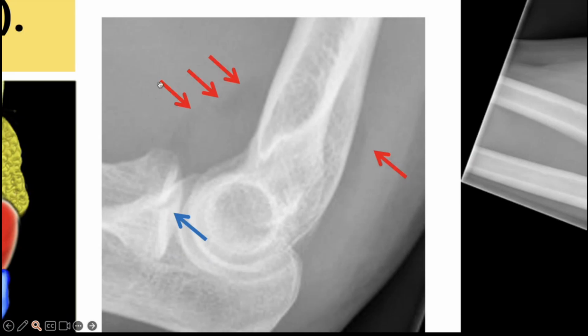So in the body, you have four densities, right? You have soft tissue, fluid, bone, and air. And the reason why we can see the different structures is because they are sort of opposing each other or forming a silhouette with one another. And the difference in two densities allows you to differentiate one entity from another entity.